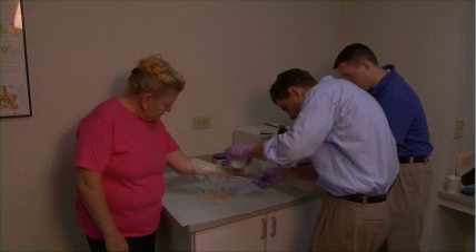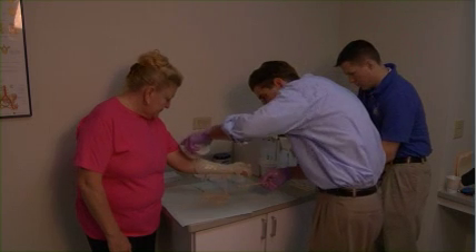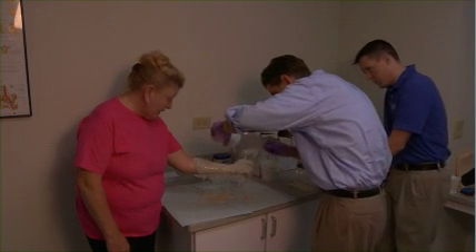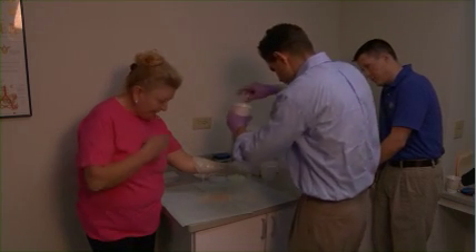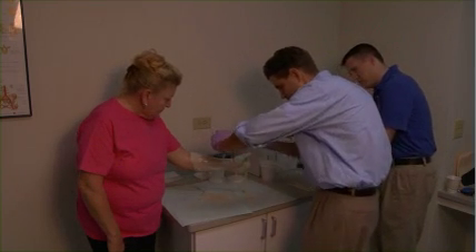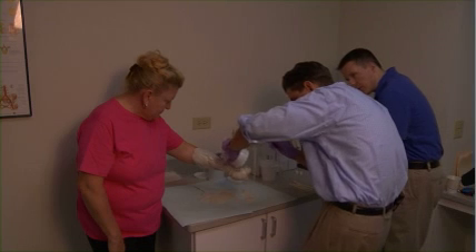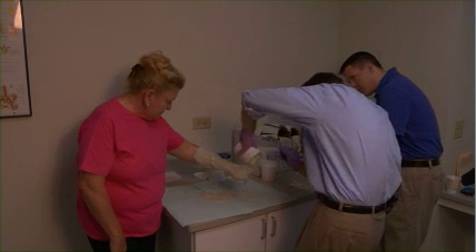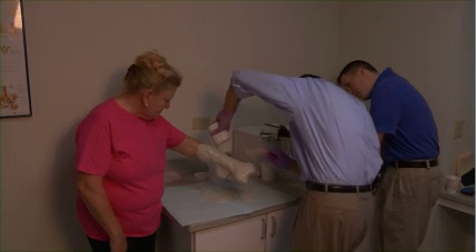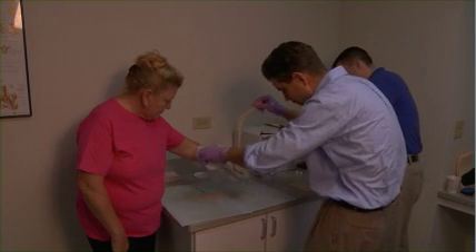All right. Doing okay? I'm fine, great. Let's start to rotate slightly, and all the way over. You've got a feel for it already. Go ahead and start on that third one — I'm going to use it. I wasn't sure if I would, but I'm going to.